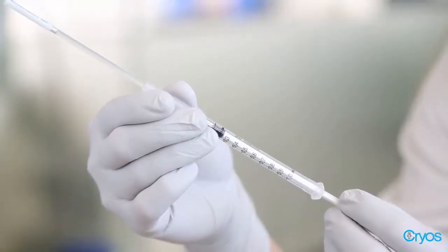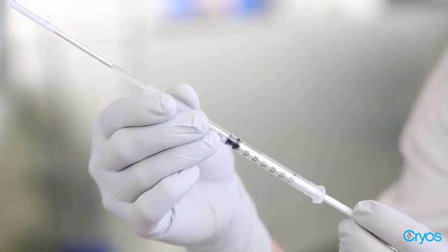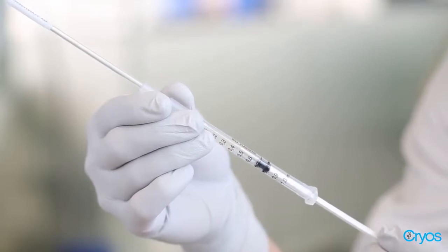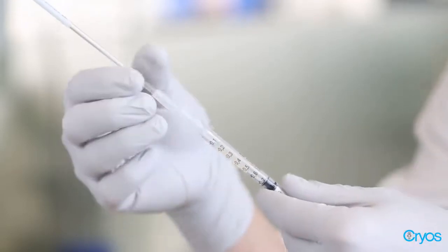Now draw the sperm into the syringe. Keep the syringe upright so everything you pull from the straw goes into the syringe. Pull until the straw is empty. The syringe will allow for up to 2 straws to be drawn at any one given time.